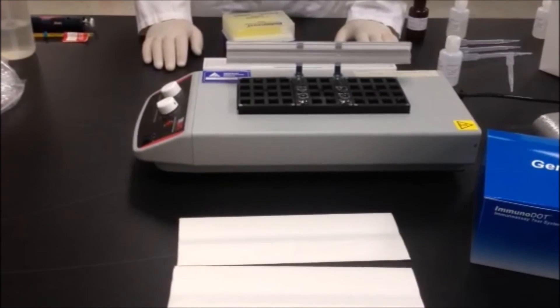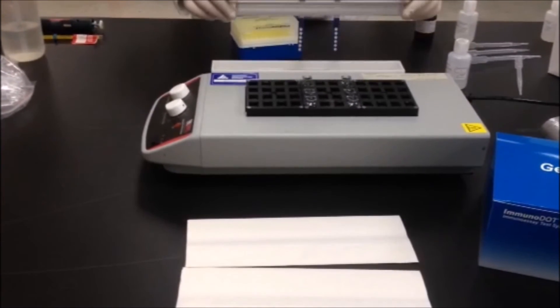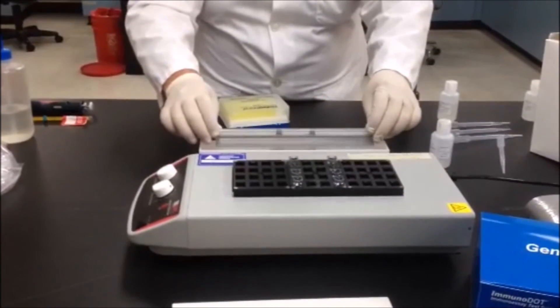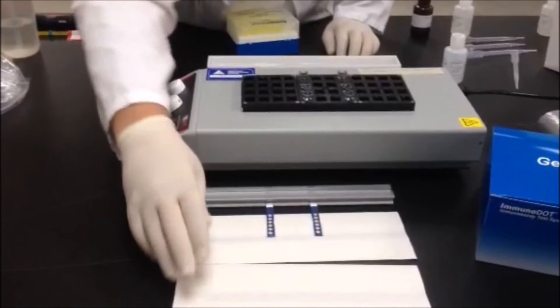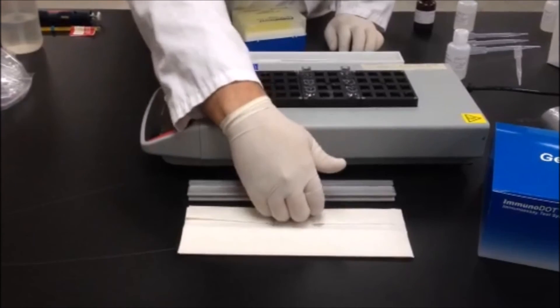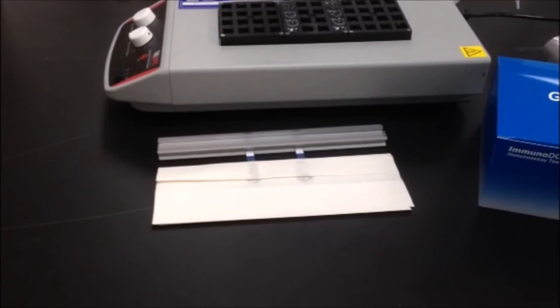After incubation, remove the assay strip from the reaction vessel and do a final wash by swishing it for 5 to 10 seconds in the wash. Now blot the assay strip gently with a clean paper towel and allow it to dry for a few minutes.